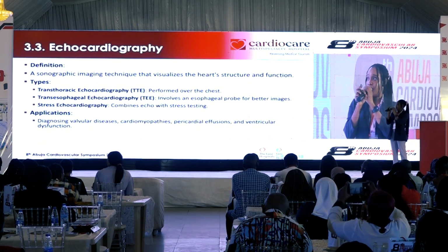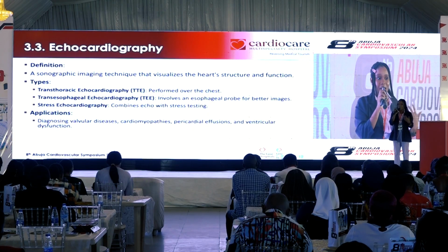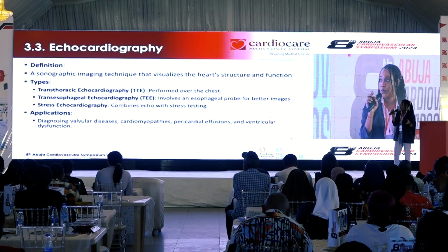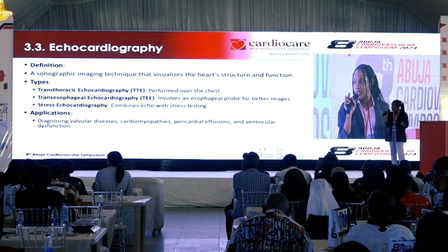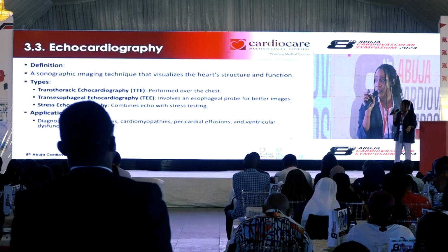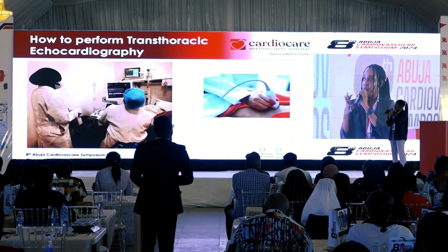Okay, so the next procedure I'll be talking about is echocardiography. It's a sonographic test that we use to check the heart structures and functions. And we have different types. We have the transthoracic, we have the transesophageal, we have the stress. And some of the indications for it: we use it to diagnose valvular diseases, cardiomyopathy, pericardial effusion, and ventricular dysfunction.